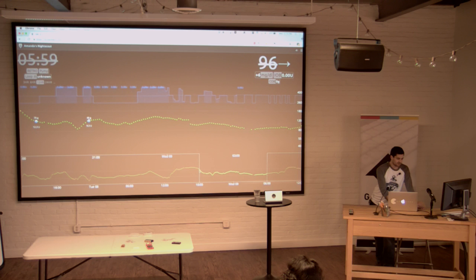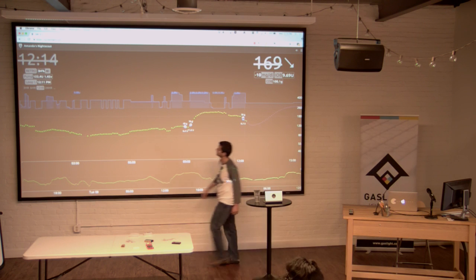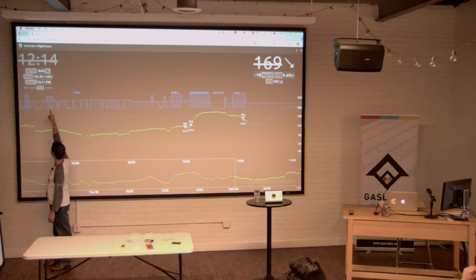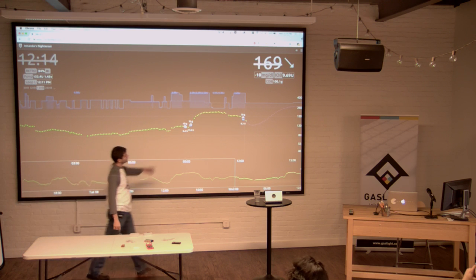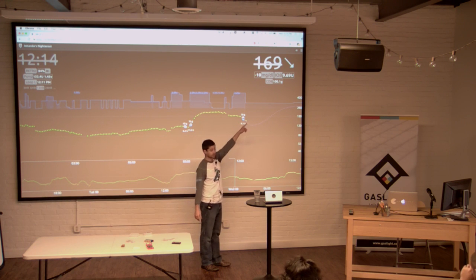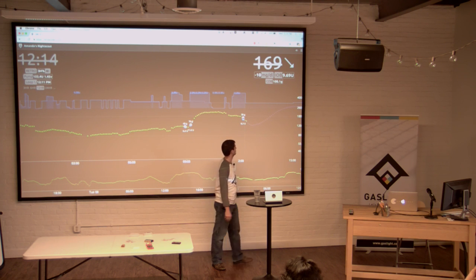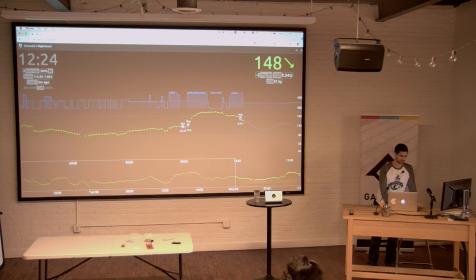You can go backward in time to figure out what happened at any point — it'll show what was going on with all the different variables. Up on the top left it'll tell you when the last loop was, what reservoir is left, how many volts the pump battery has. On the right side it tells you your blood sugar and direction, the insulin on board — how much insulin is in your body being effective — and how many carbs you have in your system. There's a lot going on with these algorithms trying to figure out what's going to happen next and react to future events.